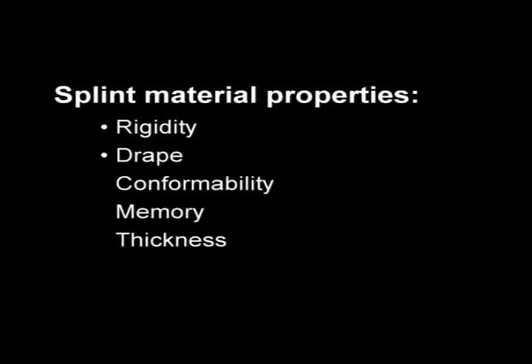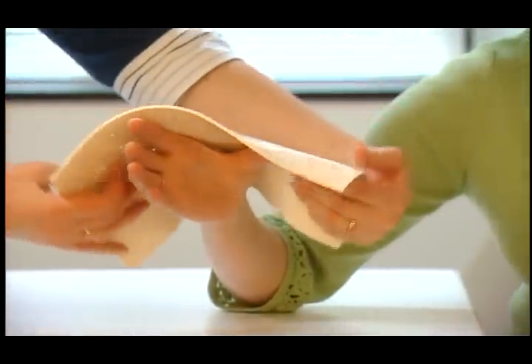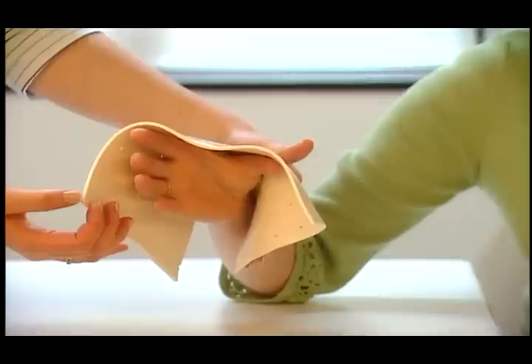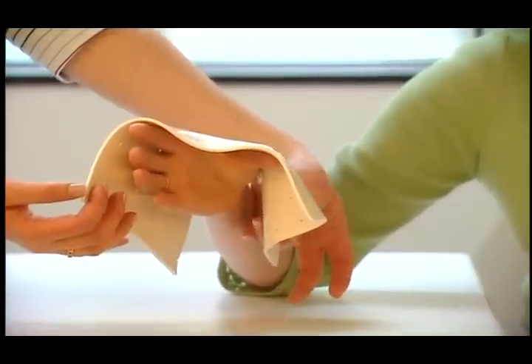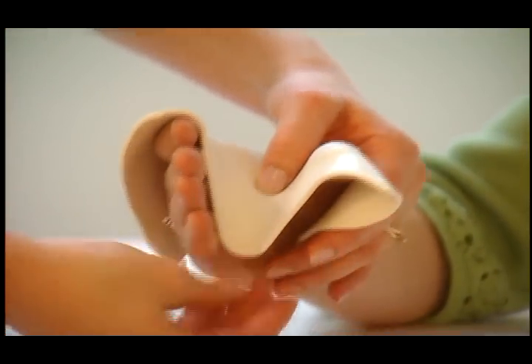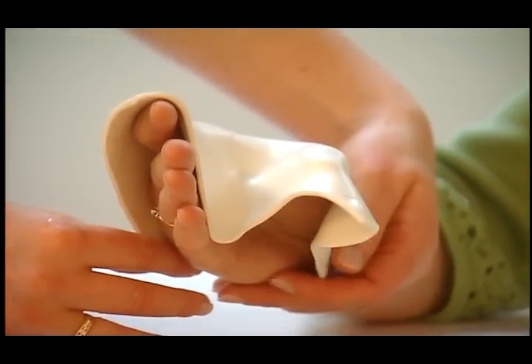Properties such as rigidity, drape, conformability, memory, and thickness can affect the way a material is handled during fabrication. For example, this Omega Max material has a high degree of rigidity and a low degree of drape, which would make it appropriate for use on a patient with spasticity. In contrast, this Polyflex 2 has a high degree of drape and molds easily around the contours of the hand.